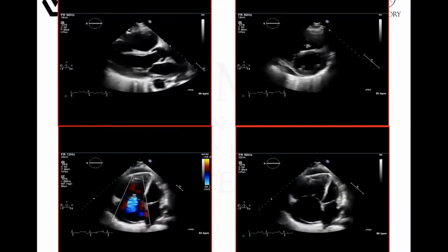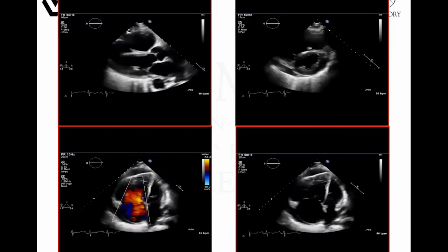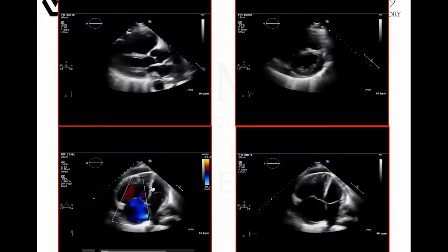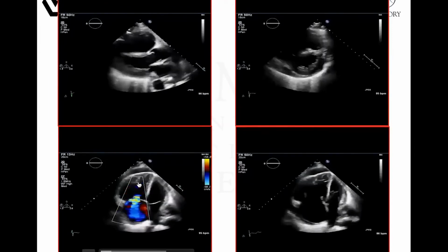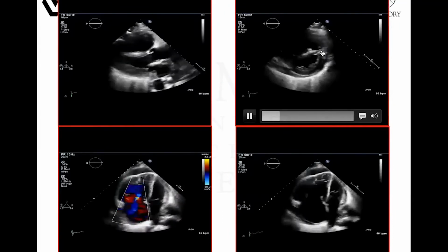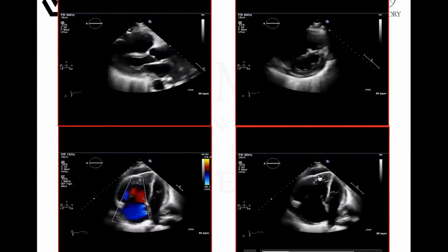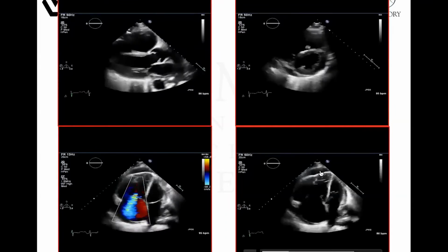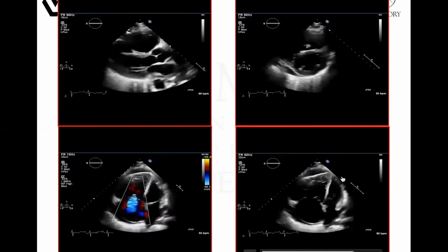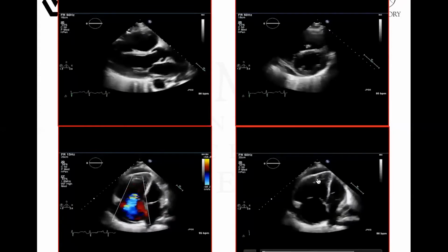It's not taken in an acute setting. The patient had already developed some level of pulmonary hypertension and RV dysfunction. You can see the RV is very poorly contractile here. And for those of you, there is almost a D-shaped septum. Whenever they bring up this issue of pericardial effusion in pulmonary hypertension patients, Dr. Bhatt will tell you that's always poor prognosis that goes with that. So that's another thing to remember.